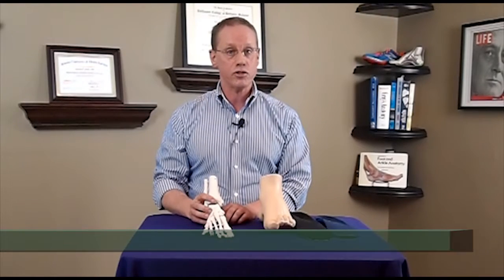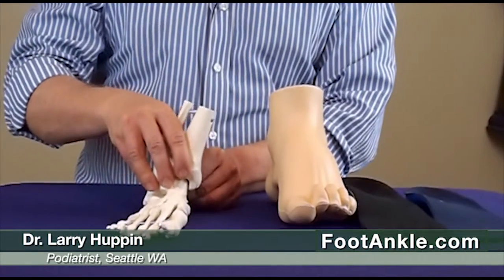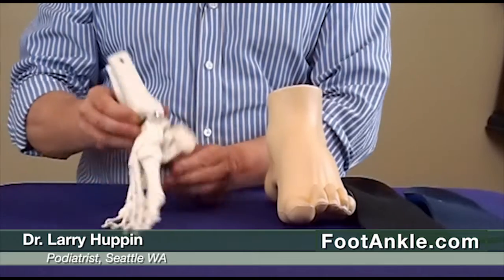Hi, today I'm going to talk about orthotics for the supinated foot. Now the foot has two primary motions. One is pronation or flattening of the foot, and the other is supination or the arch getting higher.